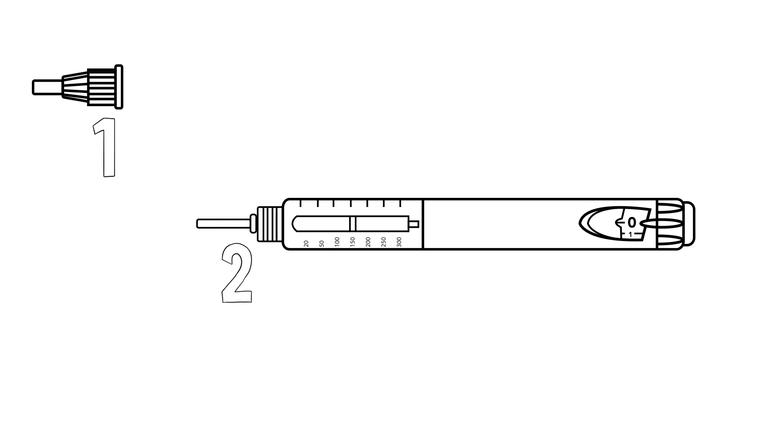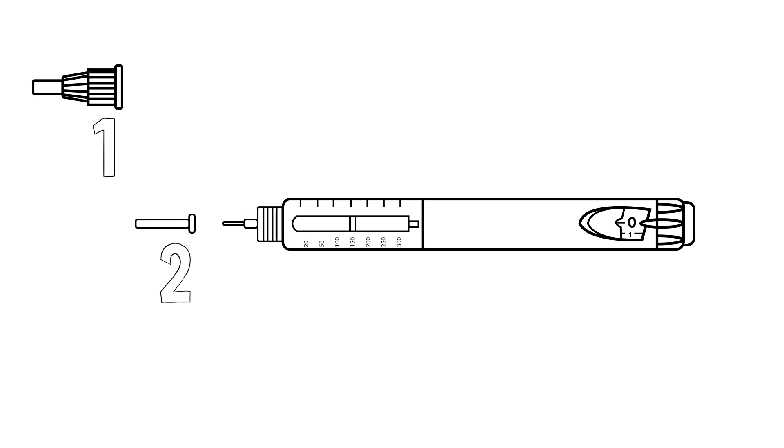You have now exposed the smaller shield. The smaller shield is there to protect you while you remove the bigger one. Remove the smaller shield and chuck it into the garbage. For your safety, you should never attempt to place this smaller shield back onto the needle.